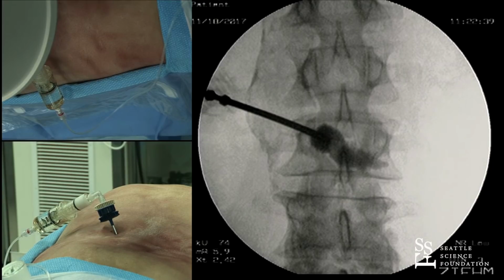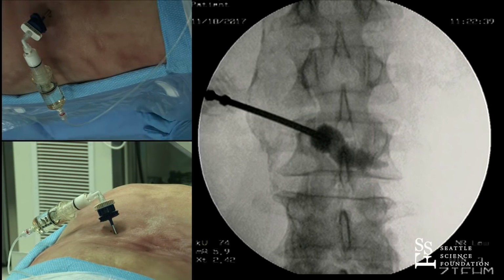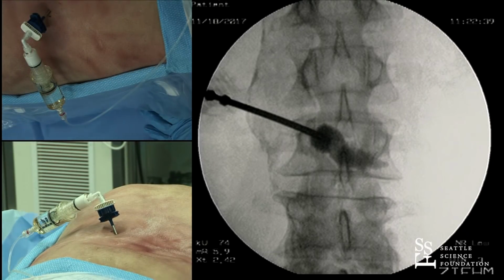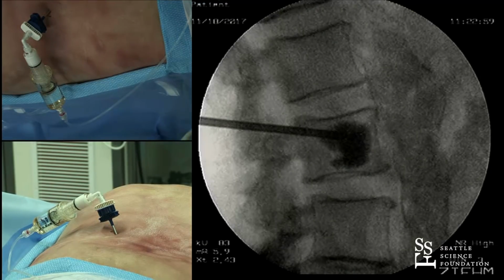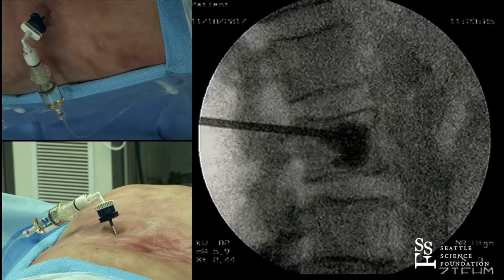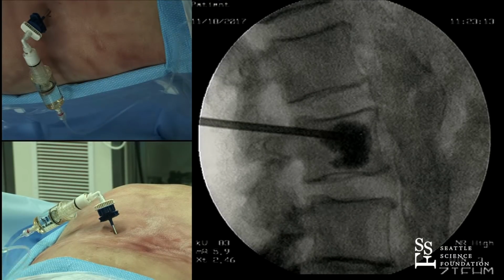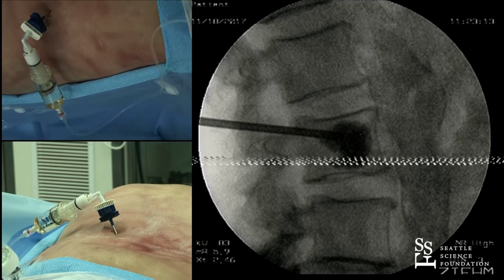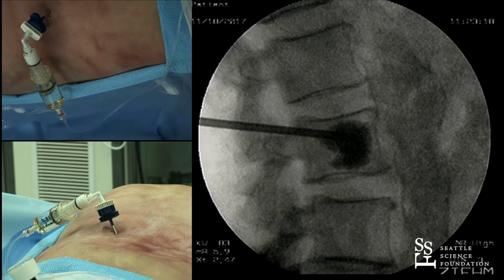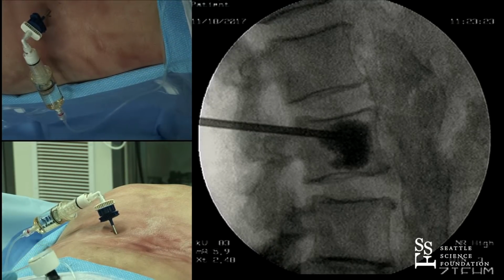Let's go back lateral, please. Doug, when you're set up in your fluoro suite, do you have biplanar for this? No, I don't have that at all. I have just a single C-arm, and some of the vascular rooms that we have are very nice, and some have biplanar, but I just use a regular C-arm. I have a set of Ziehm C-arms in one place, Siemens in the other. Neil, I wish I had biplanar for everything.